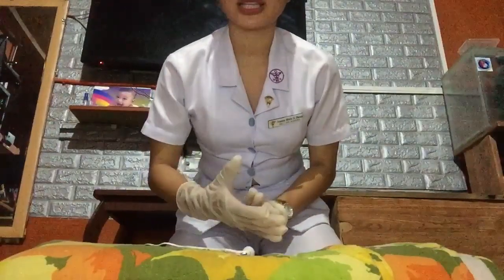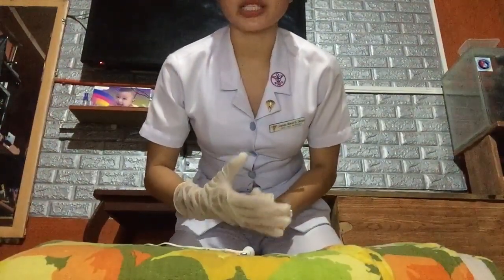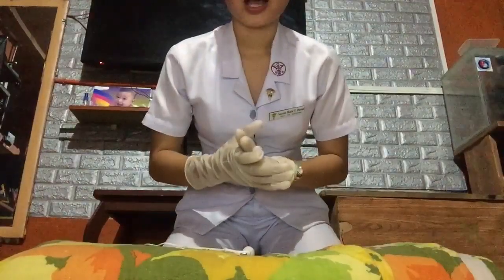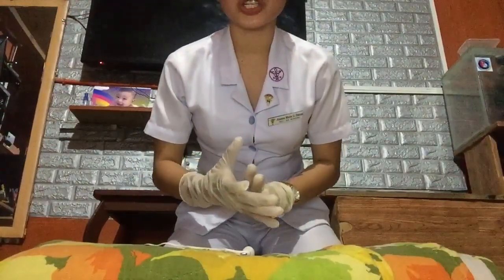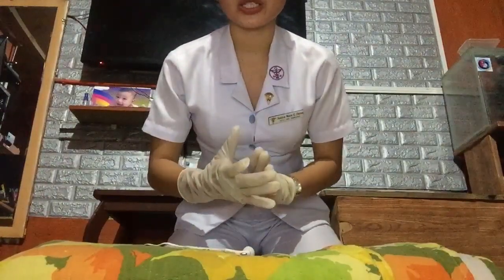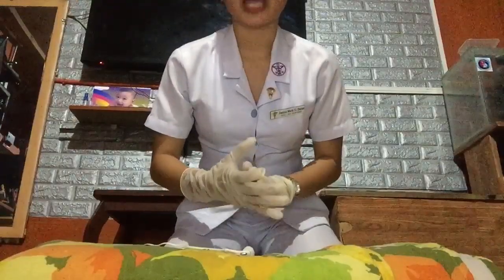This continues until the AED tells us to stop, or until the patient has been revived. So now, document the procedure done, and the time the resuscitation started up until the time it ended.